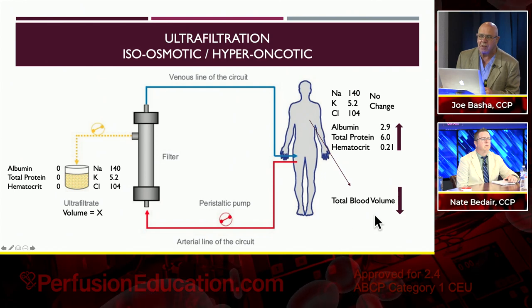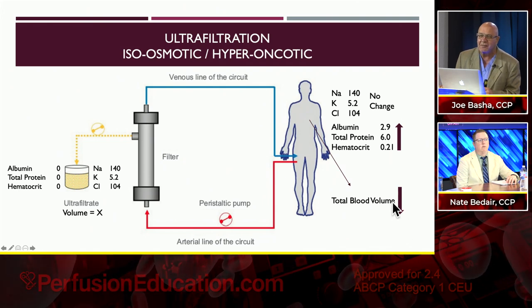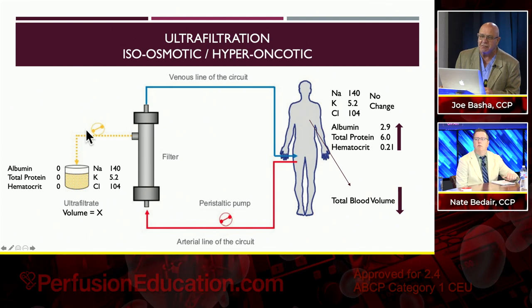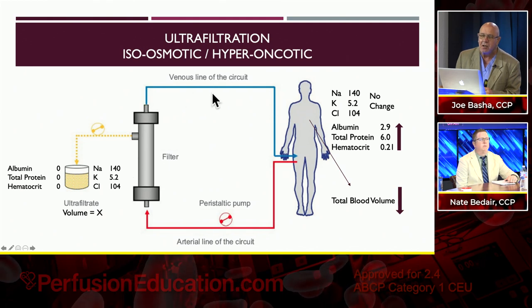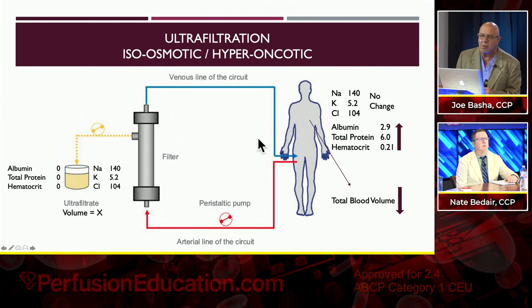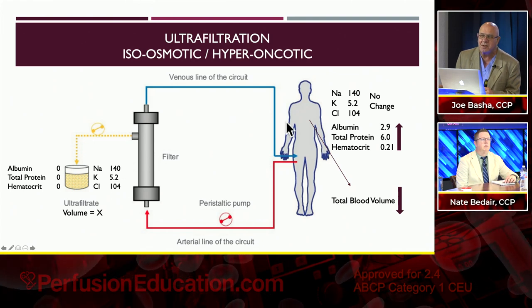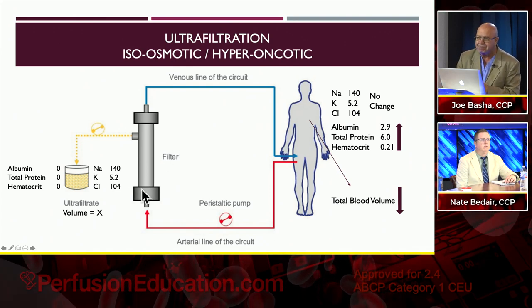But remember, total blood volume will go down. So your patient has to either be fluid overloaded or you have to replace that fluid with something to accommodate for that. And how CRRT works, in the traditional sense with convective clearance, is you're removing and then replacing, post hemoconcentration, what you want the plasma water to look like. So you're removing plasma water, replacing it with what you want the plasma water to look like. So if you have a solution that has a potassium of 4, then you will bring this down to 4, and yet this will still always be the same as that. Does that make sense to you? Absolutely. Exactly. So it's a very important concept to understand.